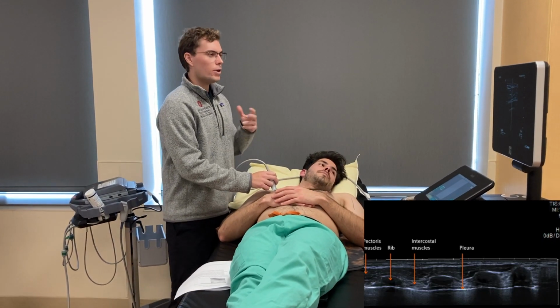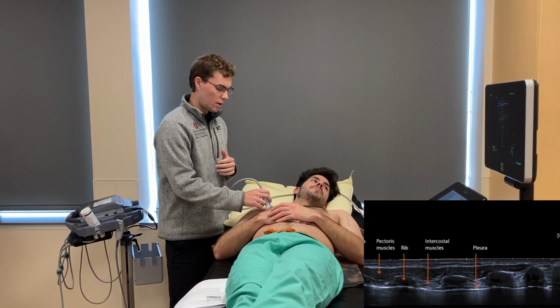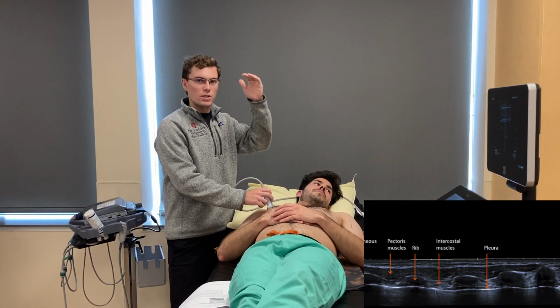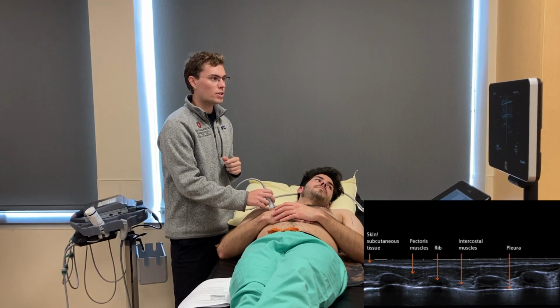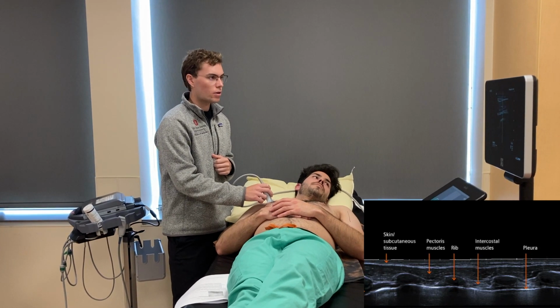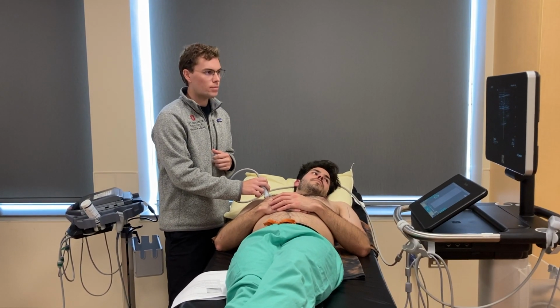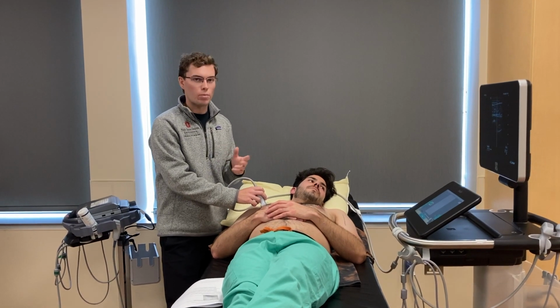So just when you're going through pointing at different anatomy, start with your skin and then your ribs. Any ribs you find, you're going to have your shadowing, which is the black shadow down the screen. So you want to get your window right inside adjacent ribs. Then you're going to have your muscle and your soft tissue, and then your pleura.